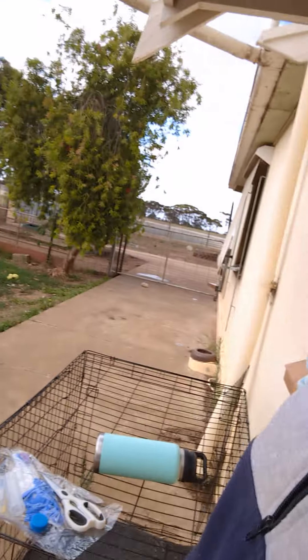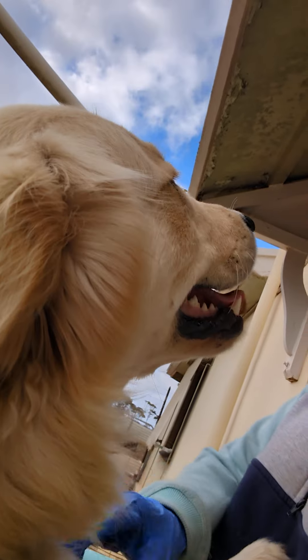Max's behavior is certainly telling me she's ready. Being an experienced stud, he's giving her kisses. Bear is showing more interest, but just to be safe and to practice my skills in doing this, I'm going to give it a run until they're ready.